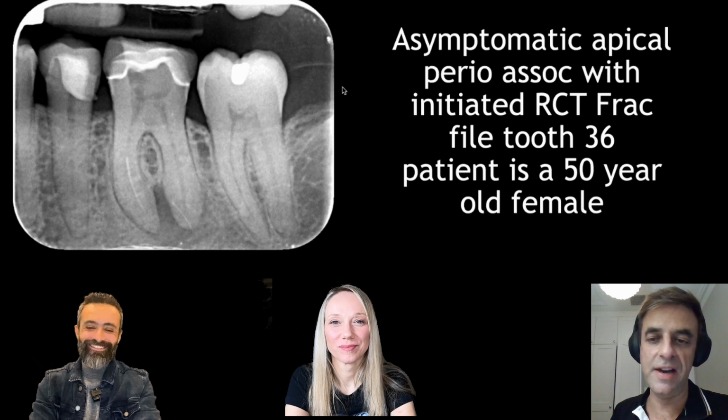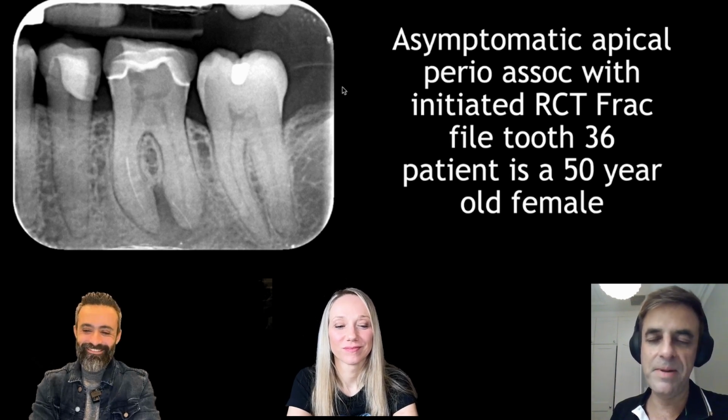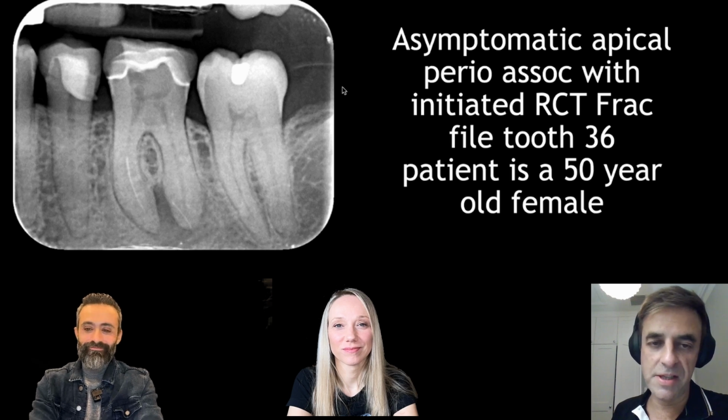I say this is the most important tooth for chewing. And if you lose this tooth at age 50, you're going to smash that second molar unless you have an implant, but the implant will be definitely lost in your lifetime as well. So this is a big, big problem. So I look at this patient and go, there's no way we would want extraction of this tooth.